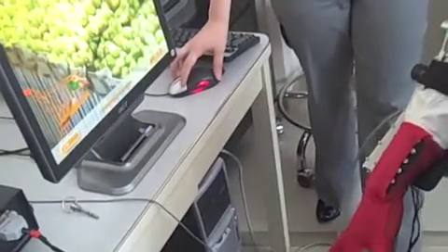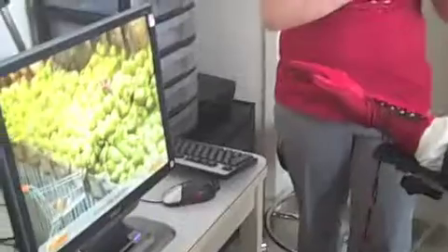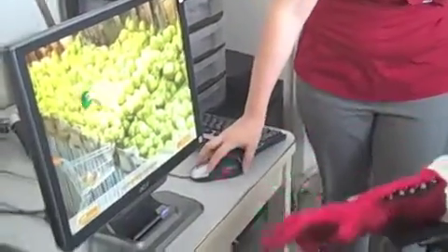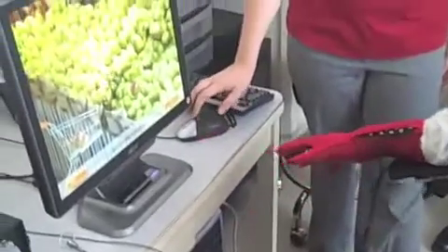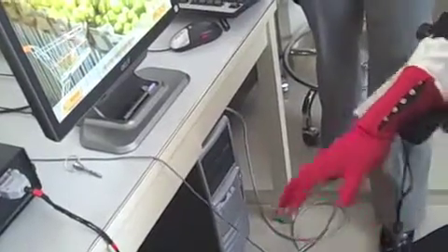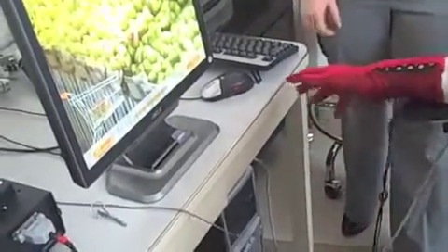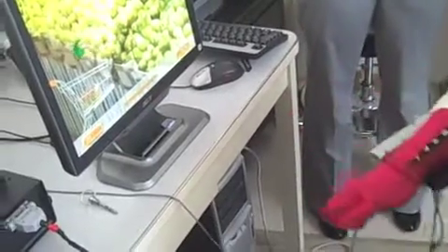If I want to make this more challenging — for example, if I want my subject to force the hand open — I can make the pressure higher, so they will have to actually open the hand. This is designed for stroke patients who have contractures, and it's a really interesting feature that we can add with the glove.